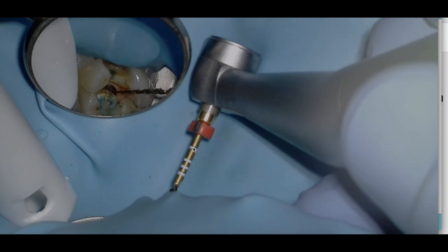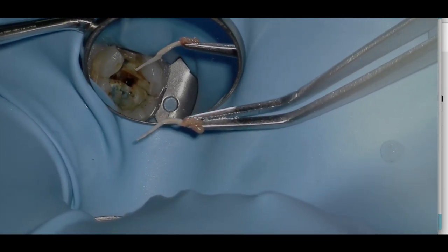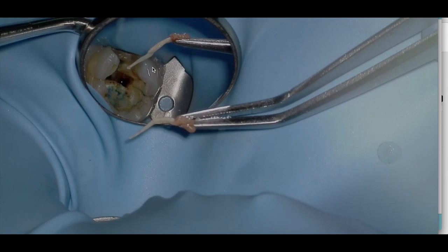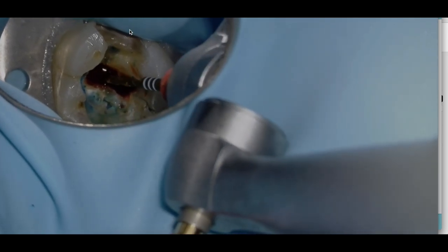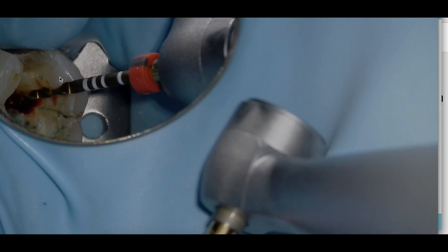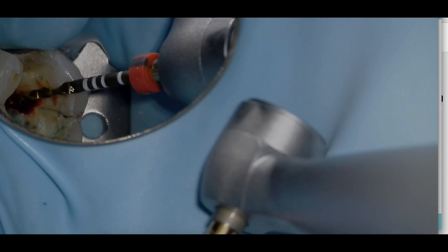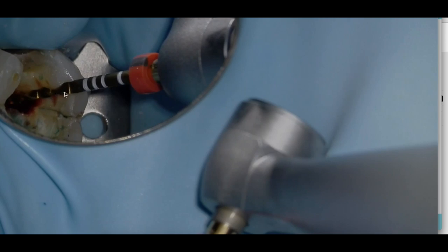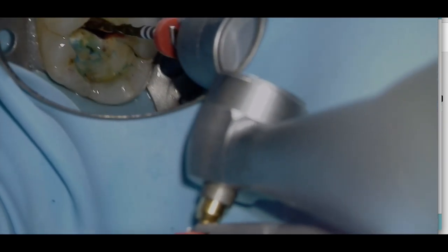I usually use a number one. I'll open up the orifice and open up the pulp chamber. The first thing I'm going to do is take my Wave 1 Gold primary and open up my orifices. We all know as dentists it's a weird thing - when we get the full pulp out it's actually quite useful because we've gotten rid of that tissue. We're going to remove that. I'm going to use my Wave 1 Gold file. I'm looking to open up my orifices just to the cutting flutes. Most teeth are roughly 19 to 21 millimeters long, and we're going to open the coronal two-thirds of all these canals - roughly 14 to 16 millimeters. I'm using the existing hemorrhage and pulp tissue just as lubricants.